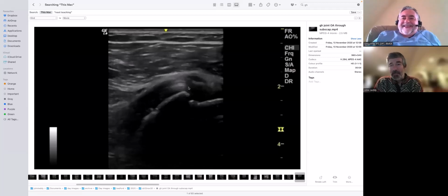Right. And everything I've read has made me think that if I did happen to notice something relevant, it would be more by luck than any sort of judgment. So yes, I'd push back on those. I would say, we're not going to see anything useful there. If you want to send someone to the vascular team and speak to someone who specializes in vascular, because you think there's a vascular element to the thoracic outlet, then maybe that has a role.